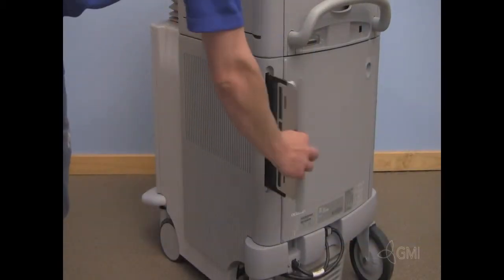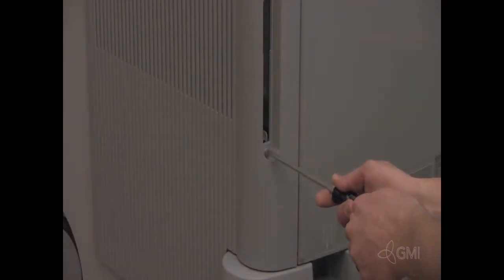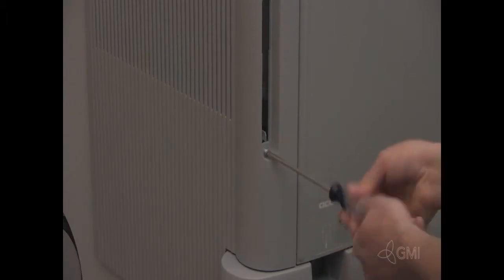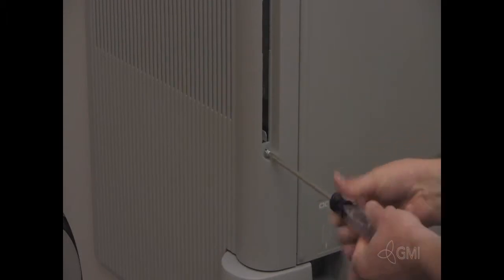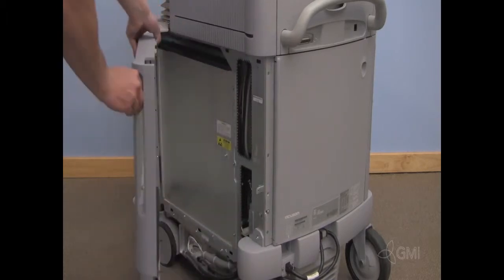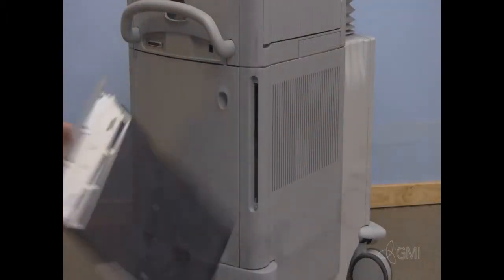Remove the air filter. Locate the screw and remove it. Pull out and remove the right cosmetic panel. Remove the second air filter.